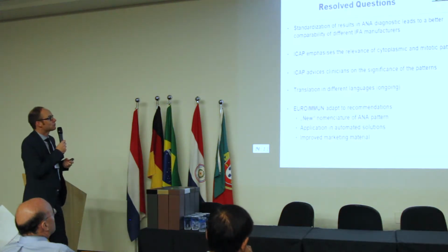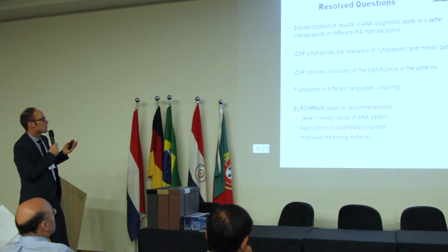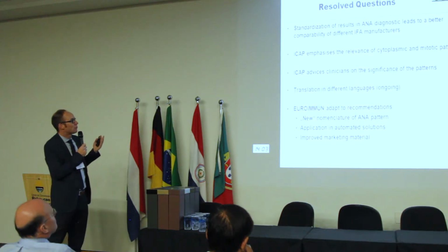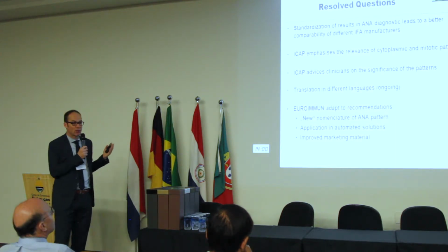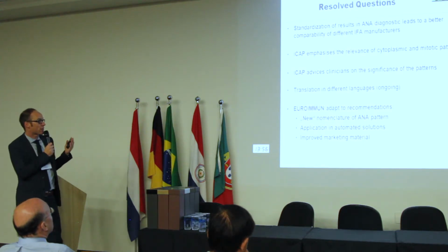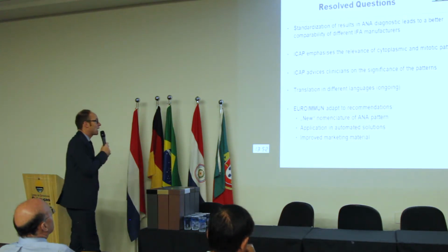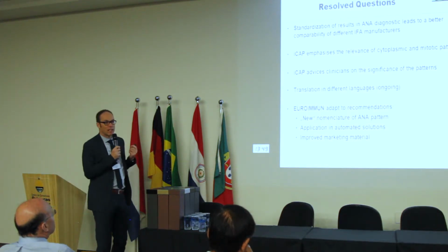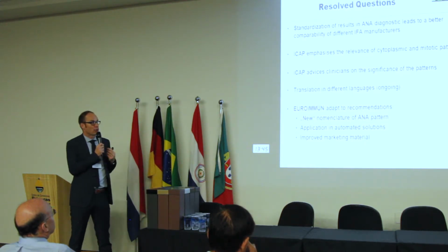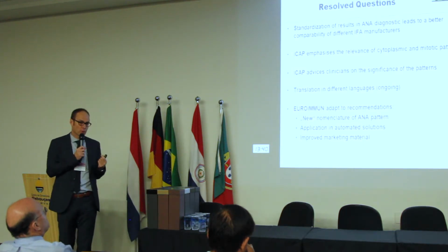So we have a lot, or ICAP has already resolved a lot of questions. So it really leads to a better comparability of different IFA manufacturers, but not only manufacturers, but also between the labs, because we are all talking about the same stuff now if we rely on ICAP. So ICAP also emphasizes the relevance of cytoplasmic and mitotic patterns, which is, in my eyes, pretty important, because there are many cytoplasmic patterns which have a clinical relevance, and we really should report that.